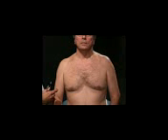I'm also going to need your help when I listen to your lung sounds. I'm going to need you to take in a little bit deeper than normal breaths, and I want you to breathe through your mouth rather than through your nose.